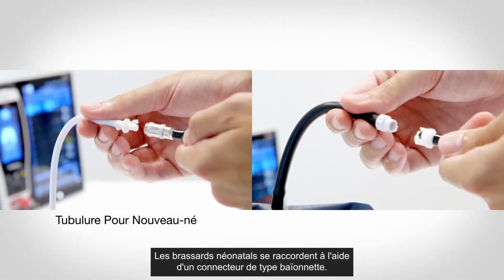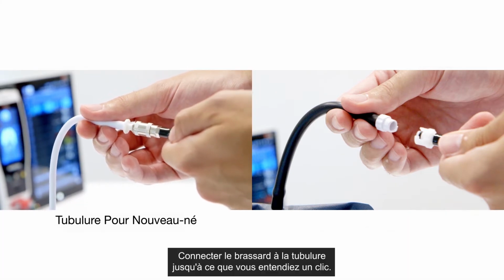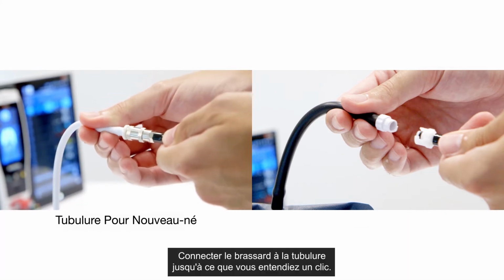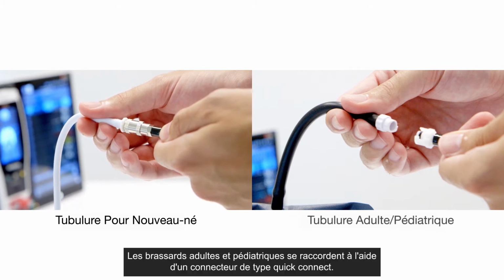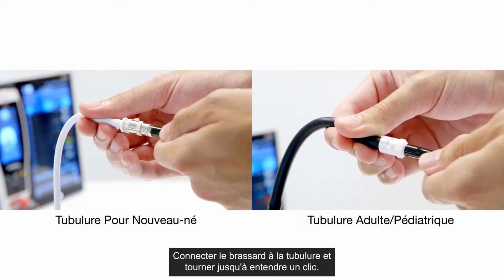Neonatal cuffs attach using a bayonet-style connector. Connect the cuff to the hose until you hear a click. Adult and pediatric cuffs attach using a quick connect style connector. Connect the cuff to the hose and rotate until you hear a click.